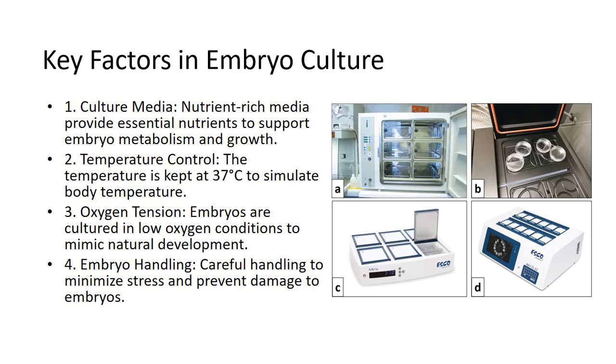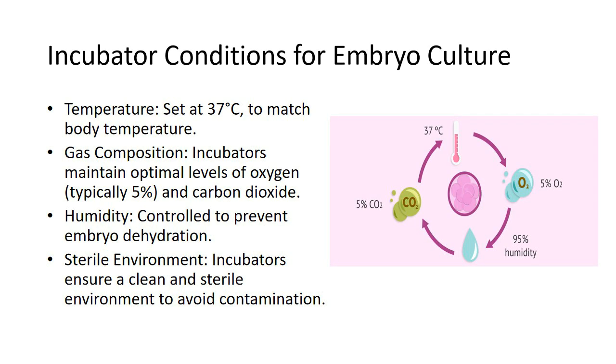Factors influencing embryo culture success. Culture media. The composition of the culture medium is essential for embryo development. The medium contains amino acids, vitamins, minerals, and growth factors that support embryo metabolism and cell division. The medium must also be designed to maintain the proper pH, osmolarity, and oxygen levels to ensure optimal conditions for the developing embryo. Incubator conditions.